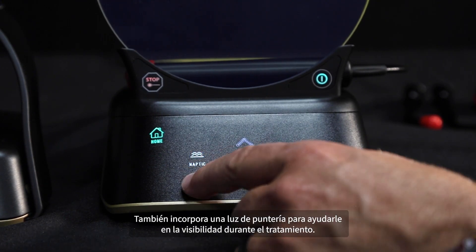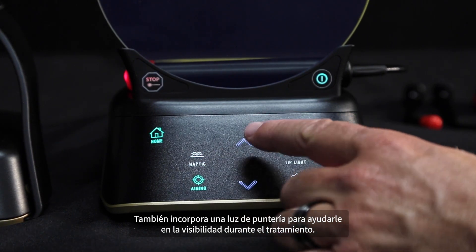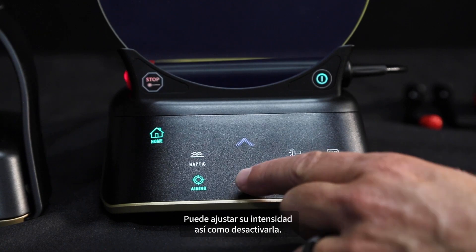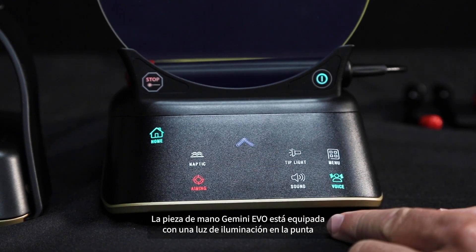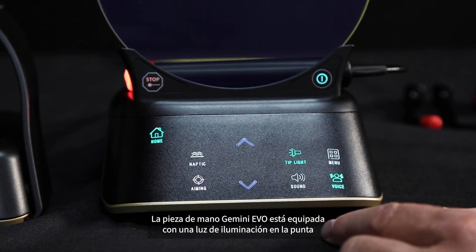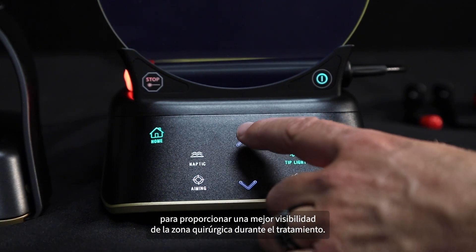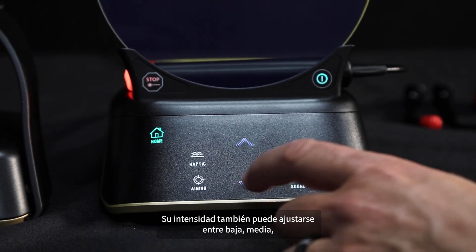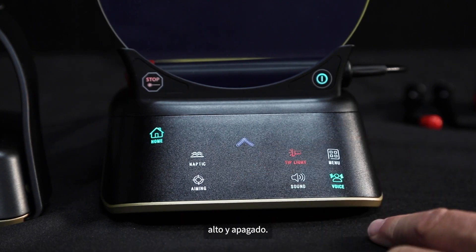An aiming light is also built in to aid you in visibility during treatment. You can adjust its intensity as well as deactivate it. The Gemini Evo handpiece is equipped with a tip illumination light to provide better visibility of the surgical site during treatment. Its intensity can also be adjusted between low, medium, high, and off.